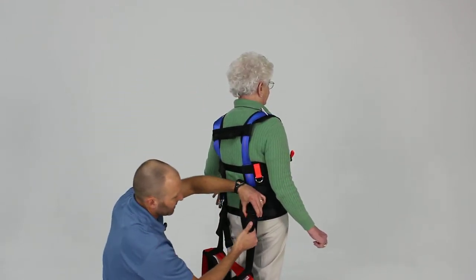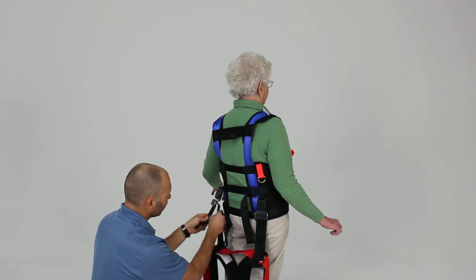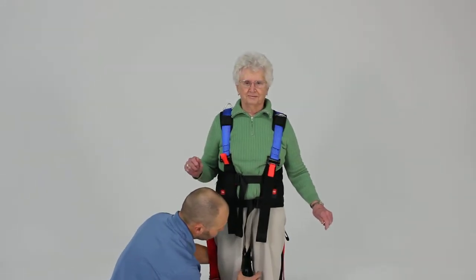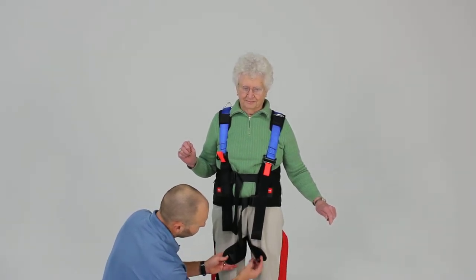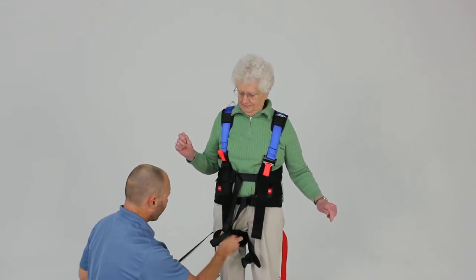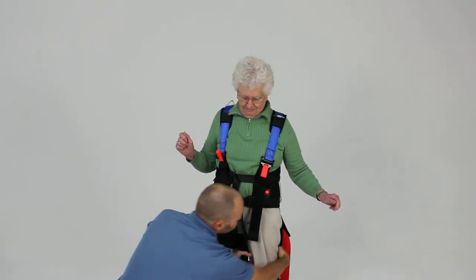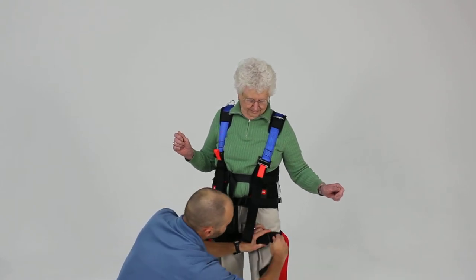I'm going to adjust the height of these so that the piece of red webbing is positioned just below the gluteal fold, and cinch that up a little bit. There are two longer pieces of thigh cuff that come down between the legs and have female ends of these plastic buckles. We're going to bring those through the legs, then take the male end and clip it in and tighten — but it doesn't have to be real tight, just take up the slack. Same thing on the left.